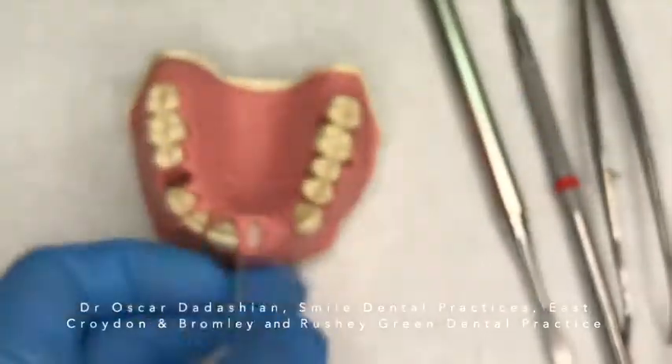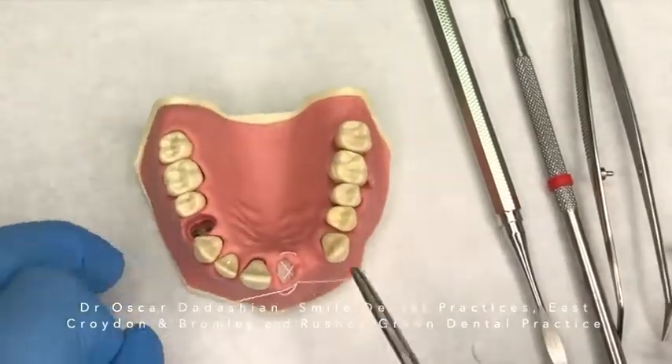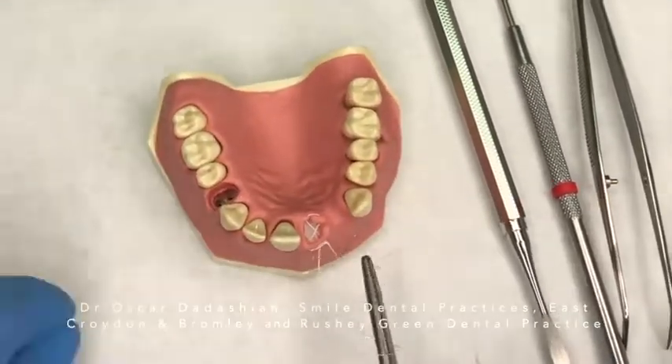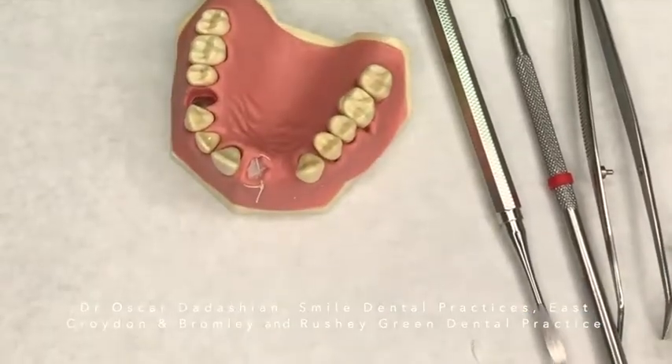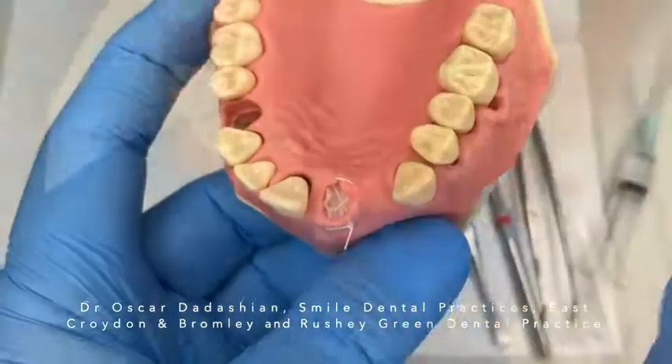I knot the suture together buccally, cut the excess off, and there you go — that's my figure-of-eight suture to keep everything in place.